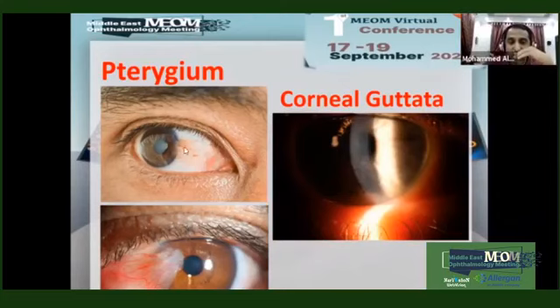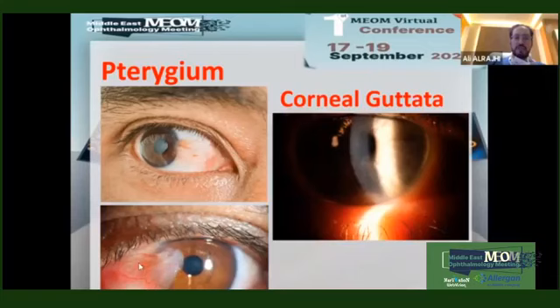There's a very small one just in the periphery, in the top one, and there is another one here. This obviously needs to be removed during the cataract surgery. For the K readings, I use this one and ignore the other. And I remove the pterygium and proceed with the cataract surgery.